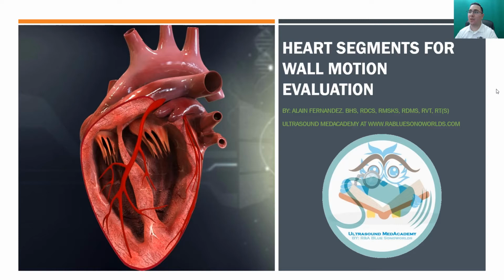Today we're going to go over the heart segments for wall motion evaluation, and I think it is a very important topic for all of those practicing in the area of echocardiography. You're going to love this. It's going to give you a lot of information, especially if you're doing a stress test in your office. This is going to be perfect for your knowledge. So let's get this done.